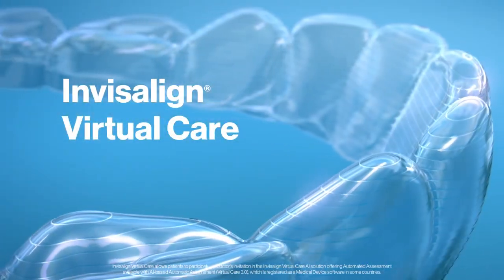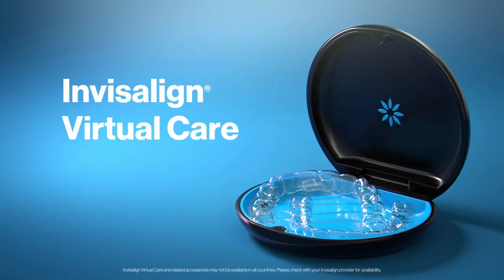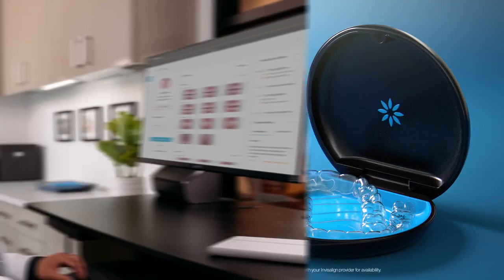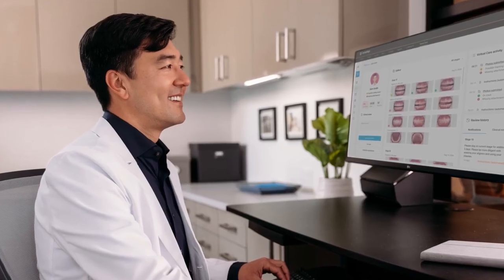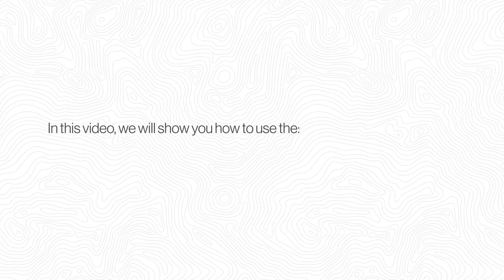Invisalign Virtual Care enables your doctor to virtually monitor your treatment progress, ensuring that your new smile stays on track. Doctors monitor treatment by analyzing clear, high-quality photos taken with the Invisalign lens. In this video, we will show you how to use the My Invisalign app and Invisalign lens.